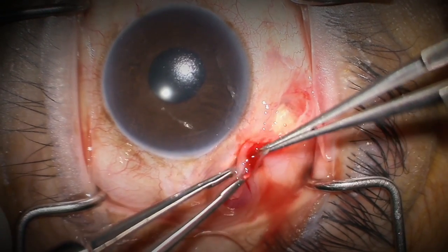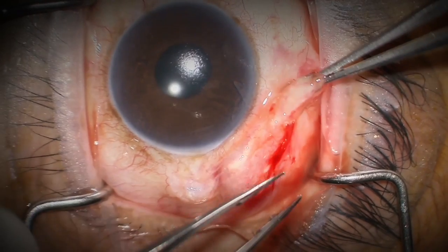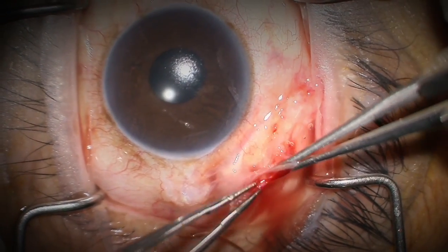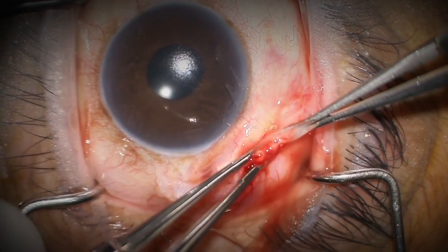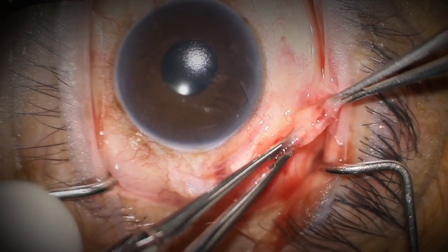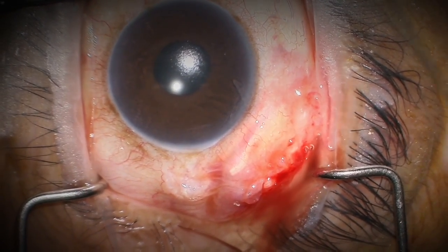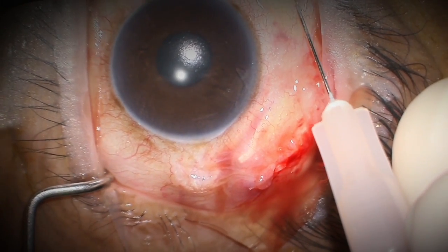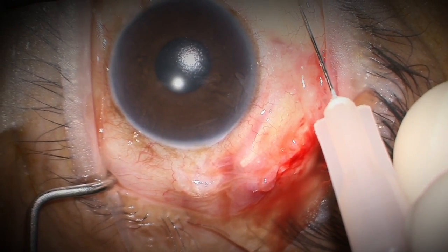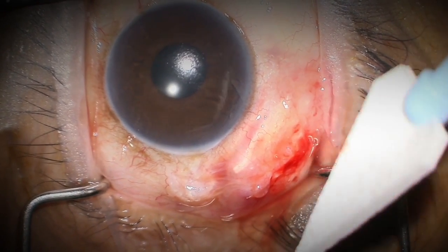I'm closing the conjunctival incision with glue and generally speaking it won't open. If it were to open, it would reveal patch graft underneath — not tube hardware — so you could monitor that, and I've never had to go back and seal one of these. Challenging now with injected steroid and antibiotic, we can see we have a watertight seal from the tube surgery.